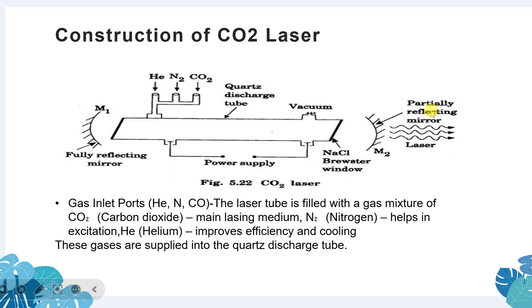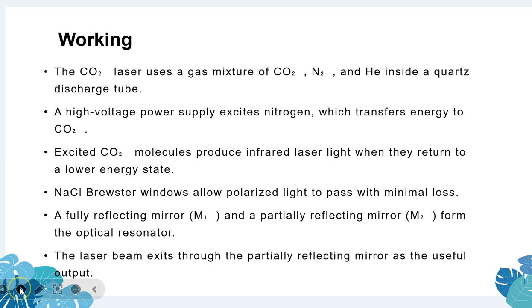In this, the second mirror is a partial reflecting mirror, and here one mirror, and here from the partially reflecting mirror only the laser will be emitted, right? Okay, let me move to the next topic.